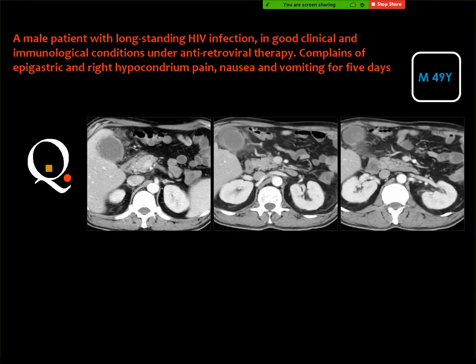Focal lesion in the head of the pancreas? No, this is the head of the pancreas, which is good. Acute cholecystitis, acute non-calculous cholecystitis. What do you think of this fluid? Perforated gallbladder? What is the diagnosis?